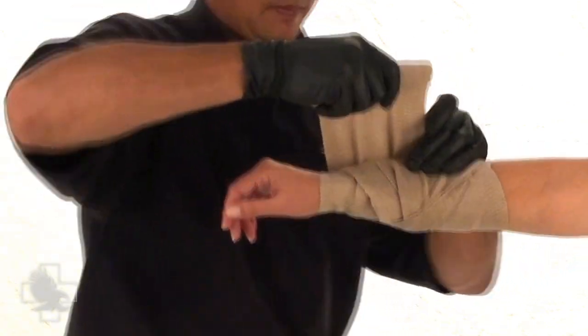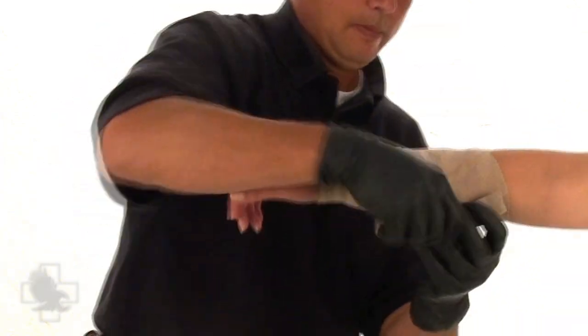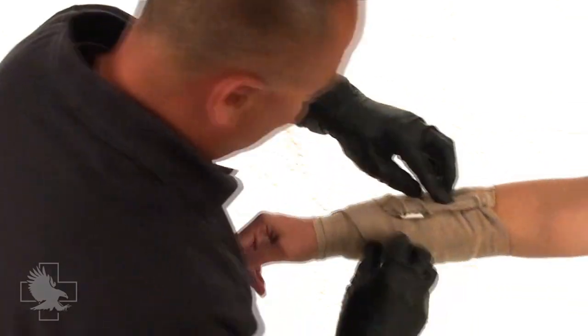If you feel that you need additional pressure, simply twist the bandage so that the twisted portion is over the pad, wrap around the limb, twist back, and finish the wrap. Finally, secure the bandage by clipping the C-clasp back onto the bandage.